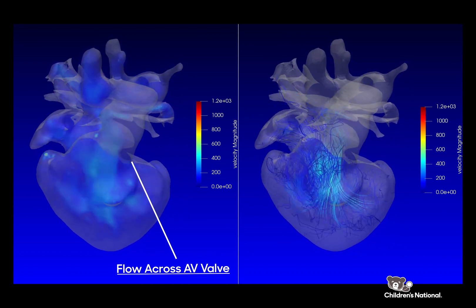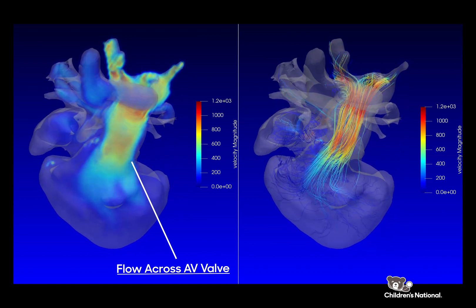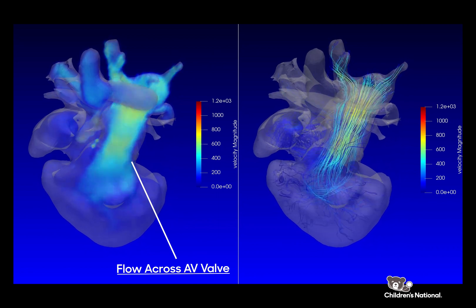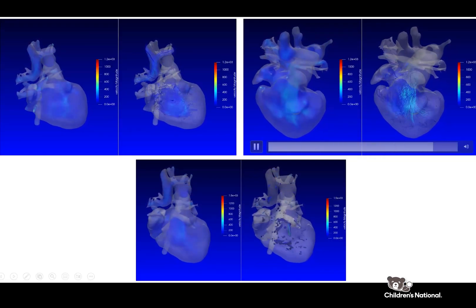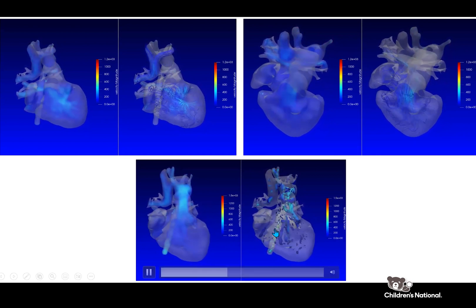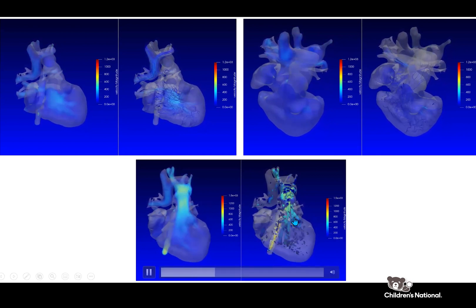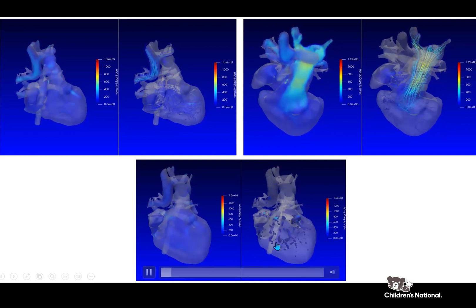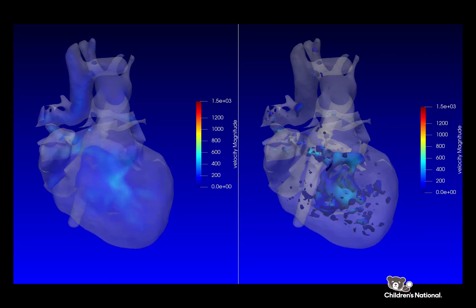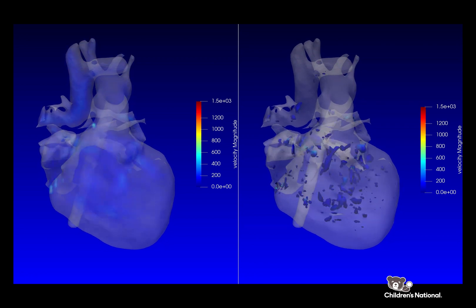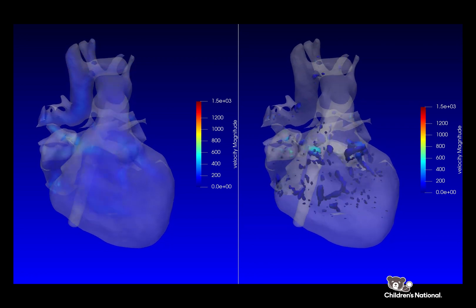You can see the blood flow here is nice and laminar — it's nice and smooth. And on contouring of the vortex, you can see that there is a ring-shaped vortex that forms when the heart fills up. This is what we would expect to see in a relatively healthy single ventricle heart.